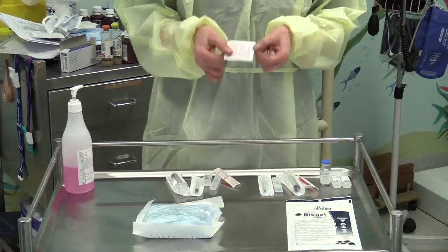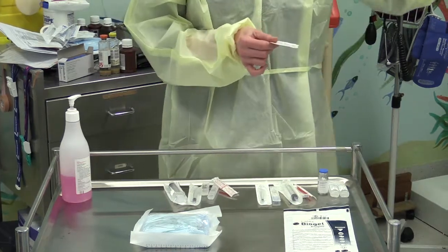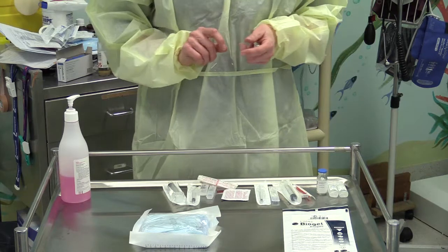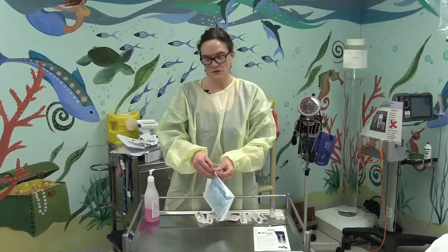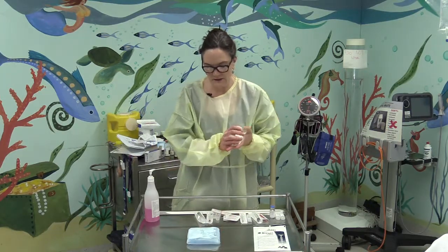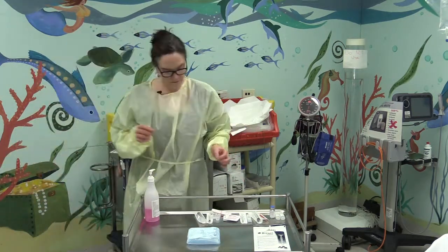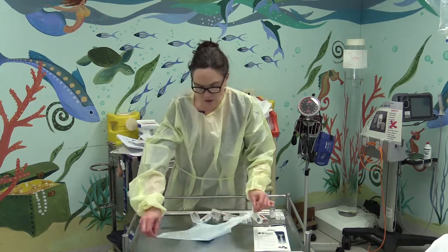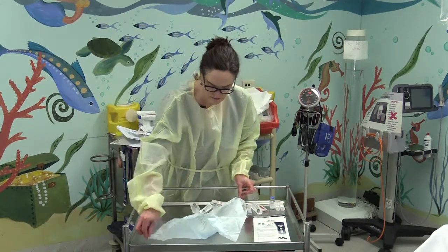And some alcohol wipes for covering the port of the burette. I'm now going to wash my hands for a minute before setting up the dialysis pack. To open up the dressing pack, it's just simply a sterile area to have my equipment. So just using the corners, not touching the centre of the sterile field.